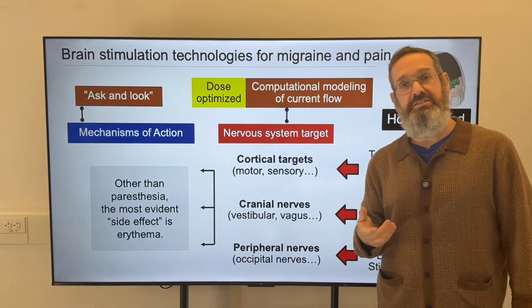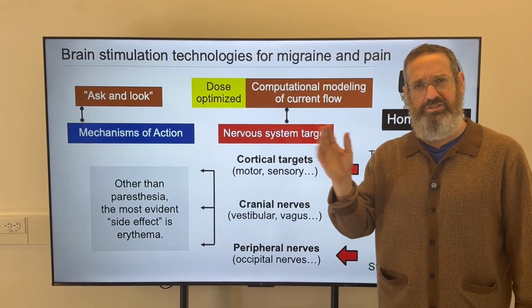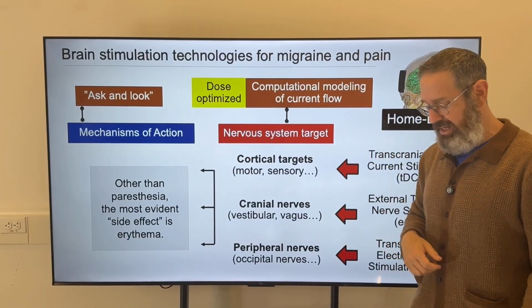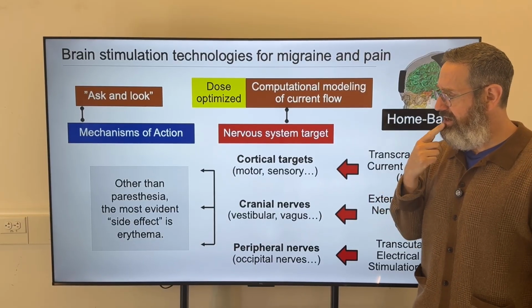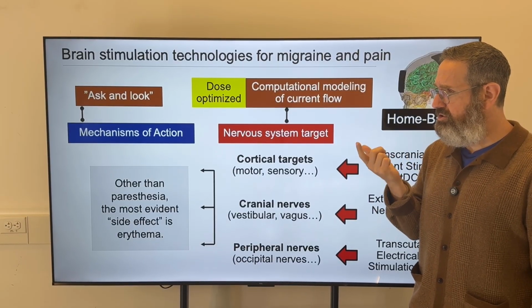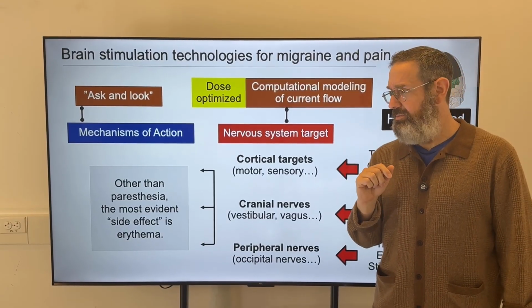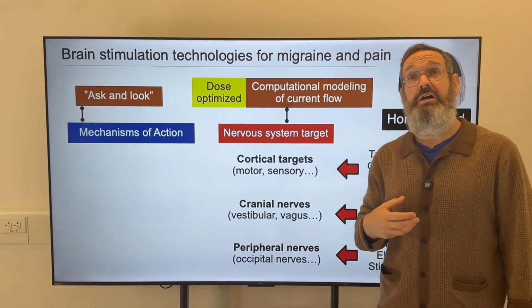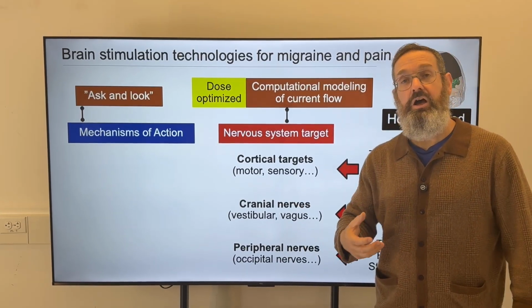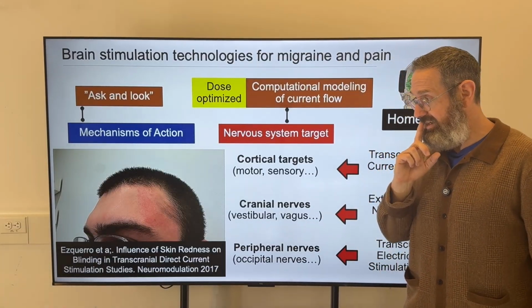And so this is normally considered a side effect of stimulation. It's not a serious side effect. The redness goes away by itself after about half an hour, but it's a very profound reddening. And it pushed us to start to ask the question, what if the reddening isn't a side effect? What if the reddening, which means this intense activation of the body's blood flow, is actually a mechanism of action?